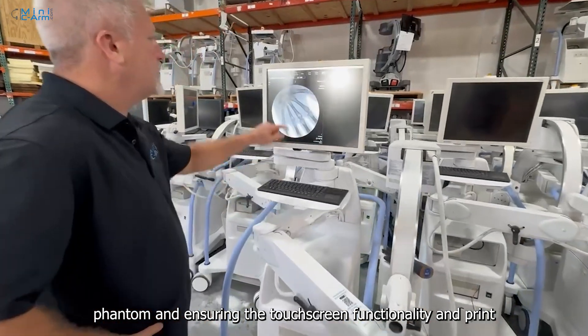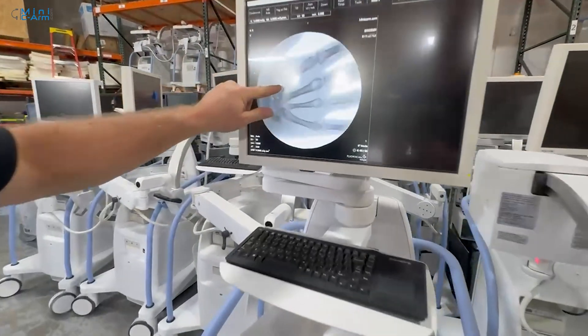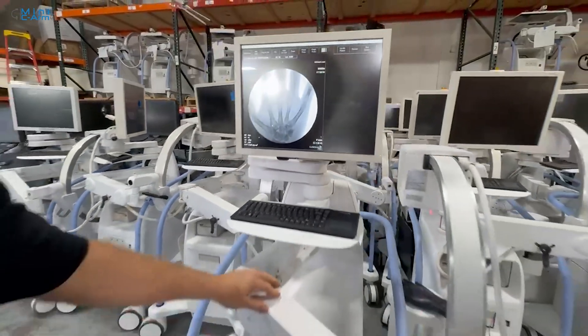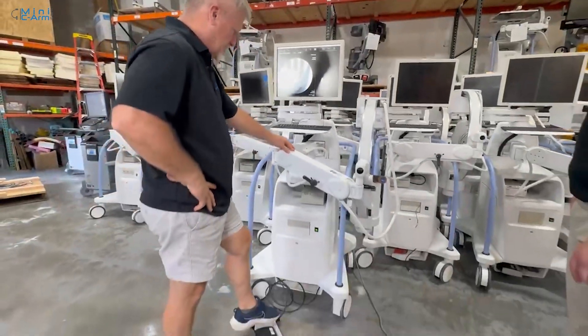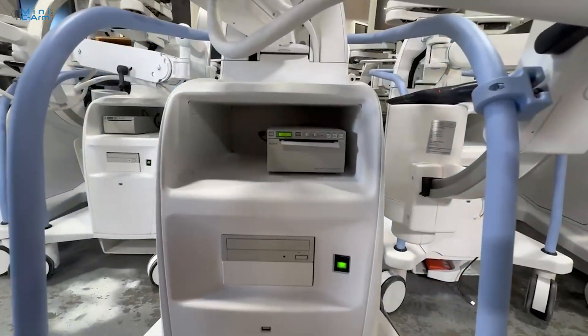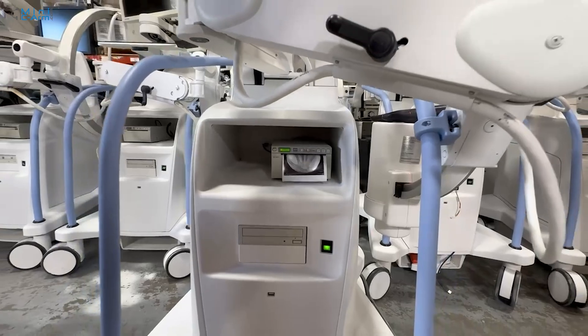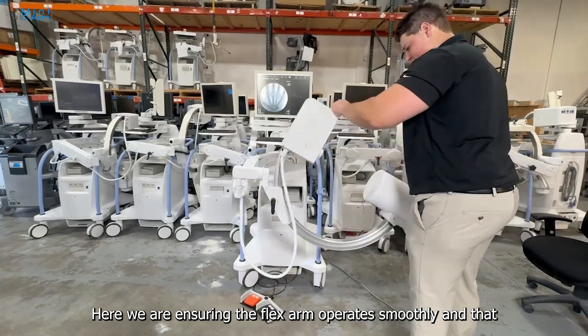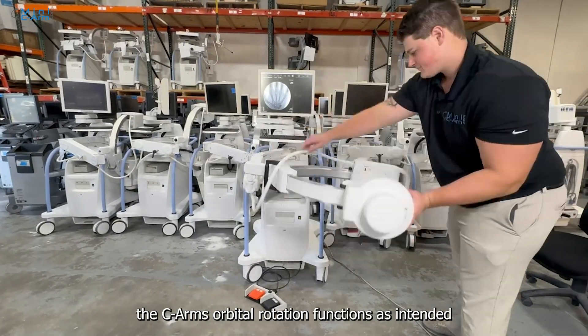Here we are ensuring the touchscreen functionality and print capabilities are operating correctly. We are also ensuring the FlexArm operates smoothly and that the CArm's orbital rotation functions as intended.